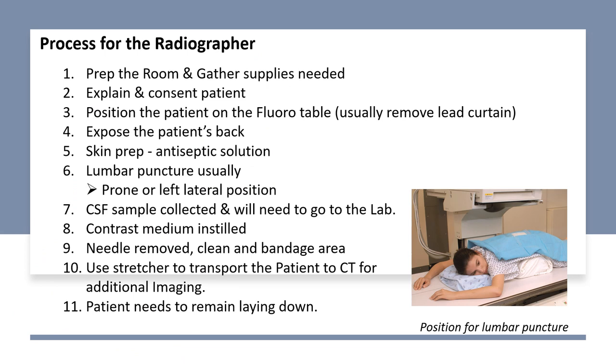Process for the radiographer. One, prep the room and gather all supplies needed. Two, explain and consent your patient. Three, position the patient on the fluoro table. Usually, the lead curtain would have already been removed before you brought your patient in. You'll have the patient lay on their belly. You want to expose their back. You'll skin prep using the antiseptic solution.